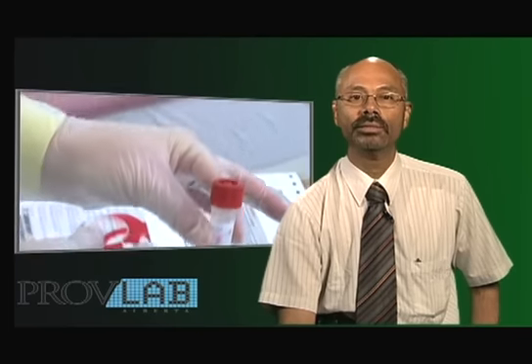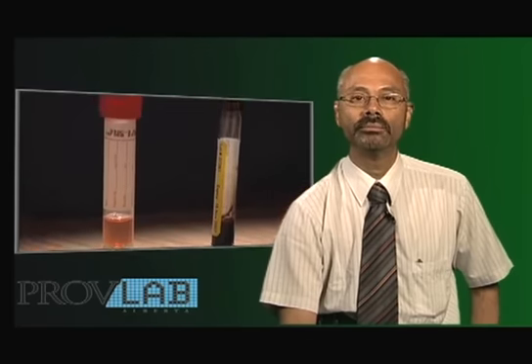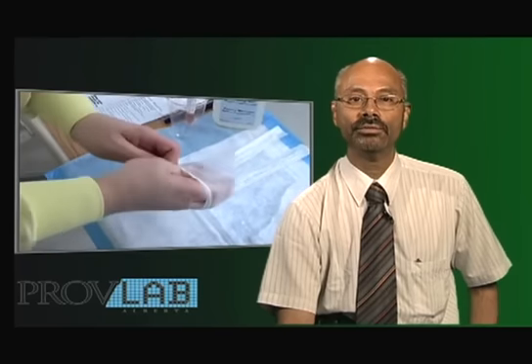The purpose of this educational DVD is to demonstrate collection of a nasopharyngeal swab using the appropriate transport medium and swabs. The first menu choice is an overview of the swabs, transport medium, and patient information to be collected. There are also 3 other segments illustrating collection of a nasopharyngeal swab from a child, adult, and senior. I should emphasize that the infection control practices shown in this DVD may differ from those in your respective facilities. Please follow the practices pertinent to your institution.